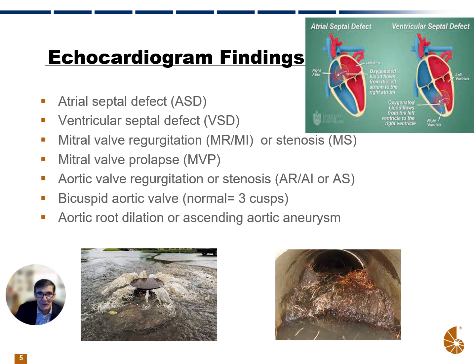Just as with the mitral valve, echoes are also used to assess the aortic valve. And the same two things can happen to the aortic valve. It can allow regurgitation, or it can be blocked by stenosis. So you may see AR or AI for aortic regurgitation or aortic insufficiency, or you may see the abbreviation AS for aortic stenosis.